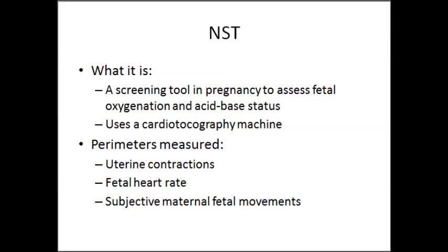And we may also give the mother a little button that she can click, and I'll talk about that in a little bit. But what we'll be measuring is the uterine contraction, so when the uterus actually contracts. And then also we'll talk about fetal heart rate as well. We do monitor that and then compare the two. And then lastly, there's a subjective factor: you give the mother a button for the machine that she pushes every time she feels the baby move. Not all baby movements does the mother feel, but that's just another option that you can throw in.